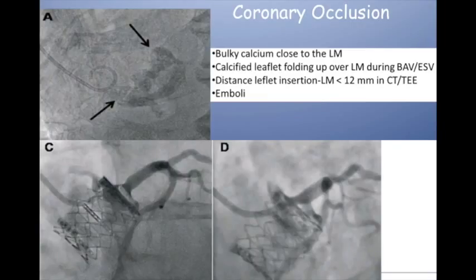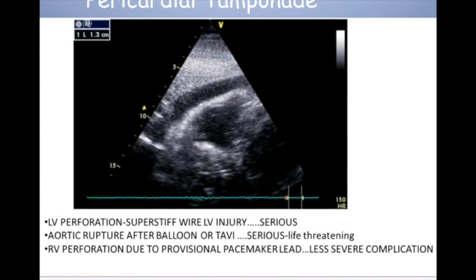Pericardial effusions are important — we can perforate with our wires and pacing wires. Annular rupture, mainly with the balloon-expandable Edwards valves, is a very nasty complication that almost universally has a fatal outcome. You can see here contrast leaking into the mediastinum, aortic dissection, pericardial effusion, and tamponade.